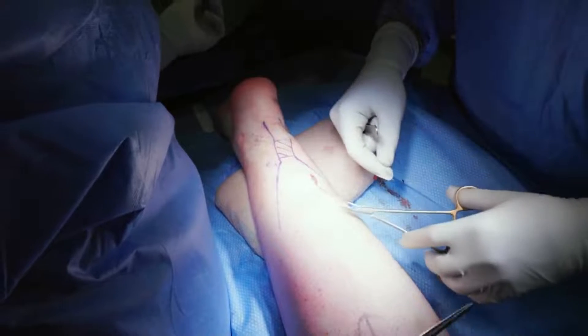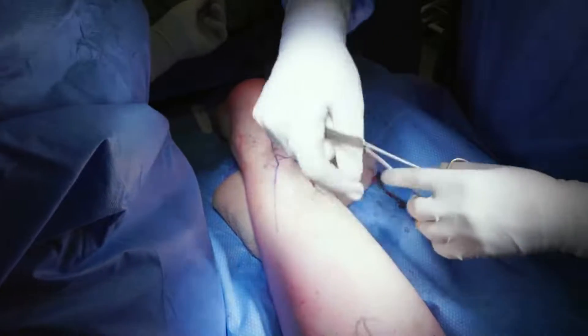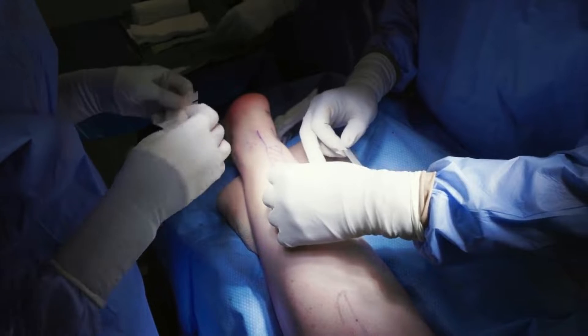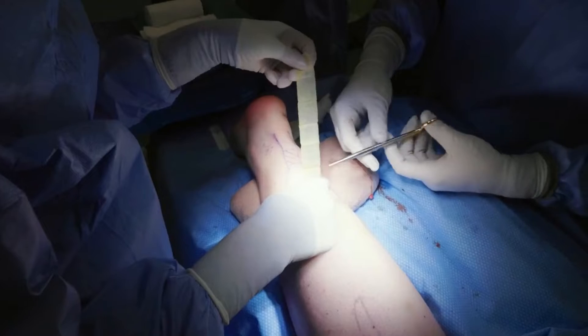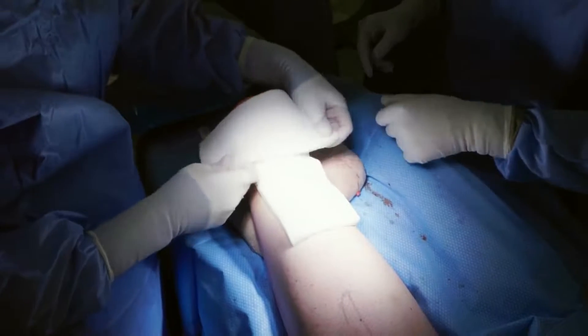After closing the fascia, subcutaneous, and cutaneous layers, steristrips as well as a nonadhesive dressing are placed over the incision and local anesthetic is introduced proximal to the operative site. The foot is then placed into a 6-inch padded splint.